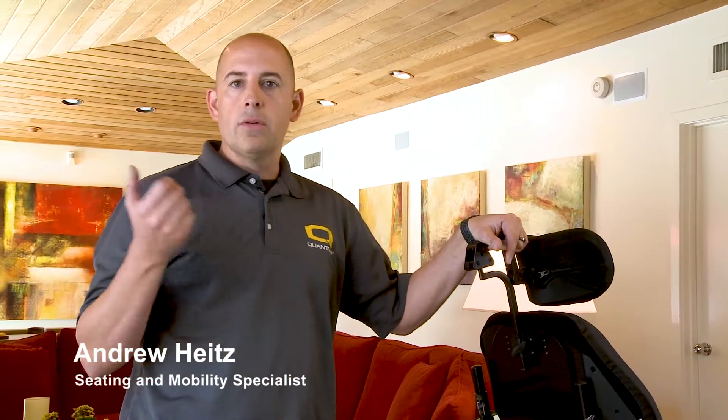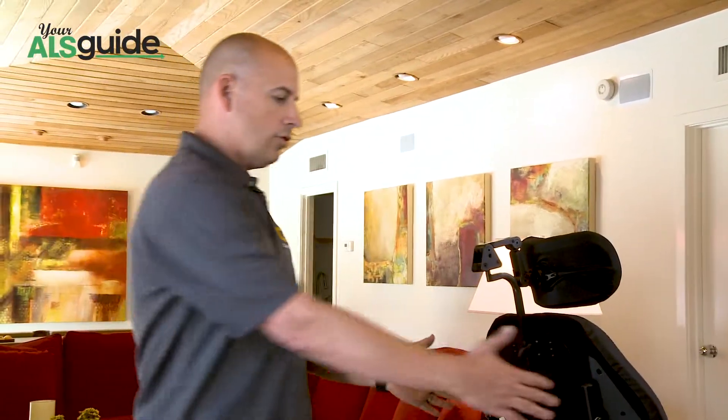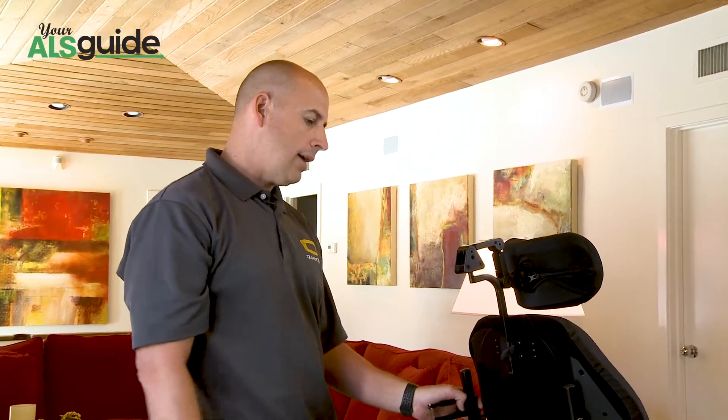One thing that does come up for ALS patients a lot is vent applications. A lot of times we're seeing the Trilogy, there's some LTV vents, there's some other ones on the market now. What we utilize is we do have vent trays. All chairs come with vent trays where you can actually mount the vent back here off of a bracket.